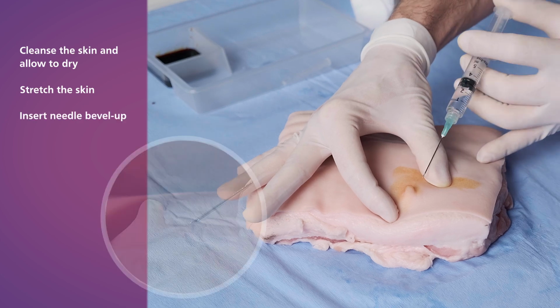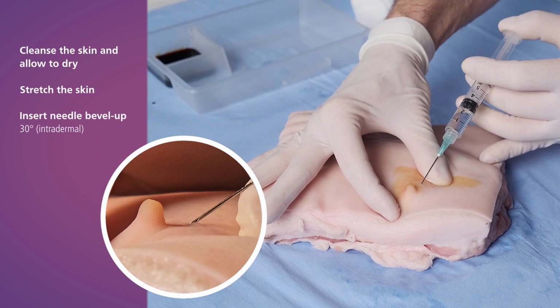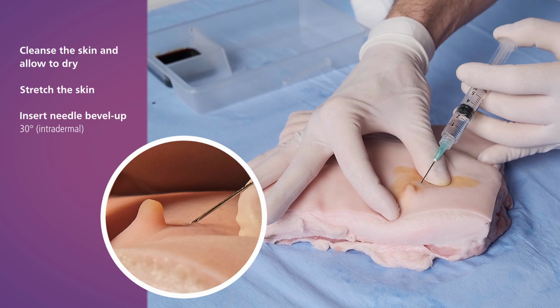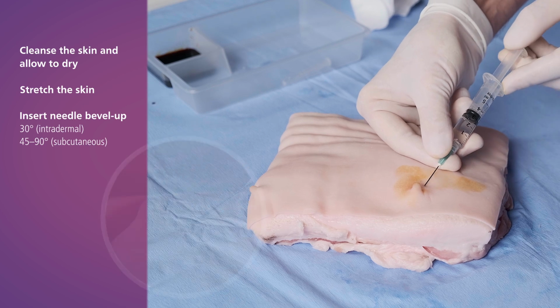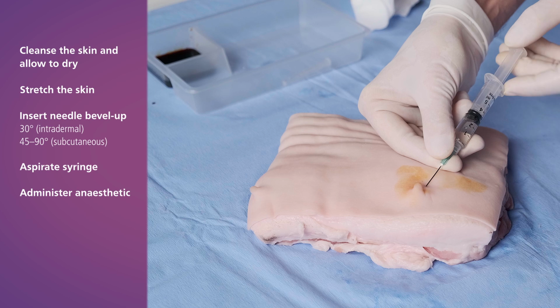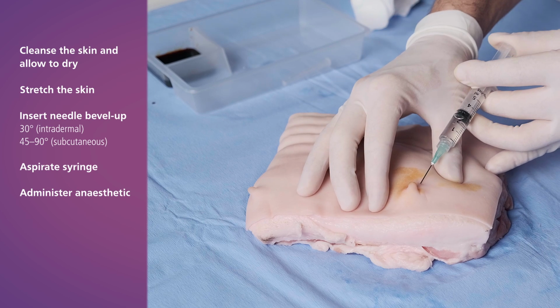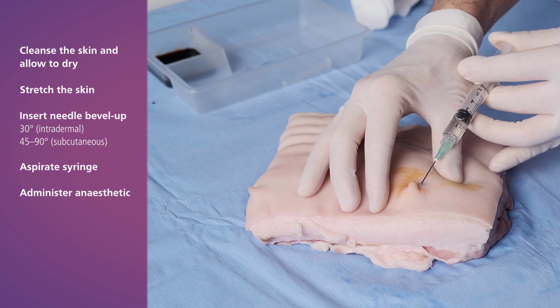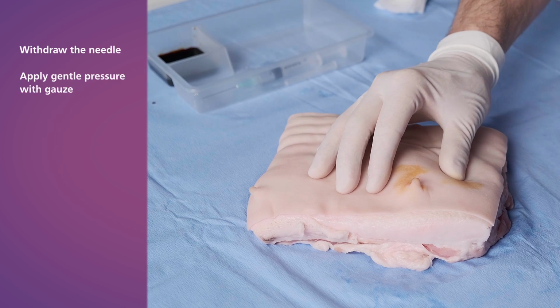Insert the needle bevel up at an angle of approximately 30 degrees for intradermal injections, or 45 to 90 degrees for subcutaneous injections. Briefly aspirate to check for blood return before injecting. This ensures that you are not directly injecting local anaesthetic intravenously. Once the anaesthetic is administered, withdraw the needle and apply gentle pressure with gauze.